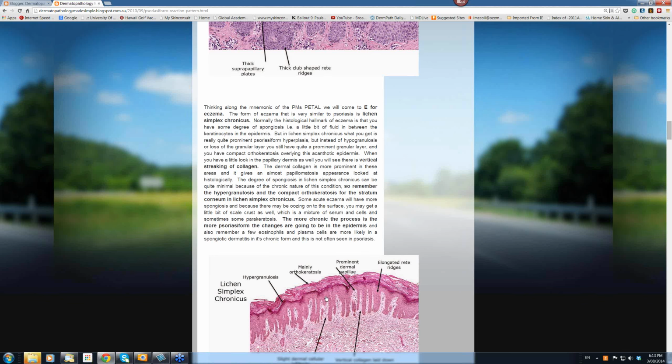Occasionally, though I've said this is a form of dermatitis, you often don't see any actual spongiosis here. It's the same thing clinically. You don't see these things weeping much, like in lichen simplex chronicus. So spongiosis is fluid in between the keratinocytes that sometimes breaks through onto the surface with little erosions, and that's what causes the weeping. Well, you're not going to get that in lichen simplex chronicus.